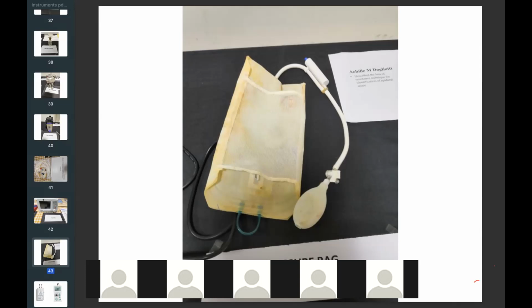The pressure in the pressure bag damps the small disc which is there in the arterial transducer, it keeps the disc down. And that is how when you do a square wave test in your arterial line, you can make out whether it is adequately damped, under damped or over damped. Again, within this capacity I will not be able to tell you this, but I will tell you when I take a class next.